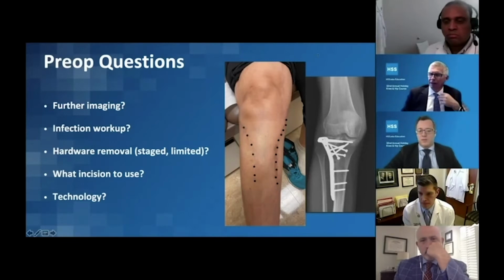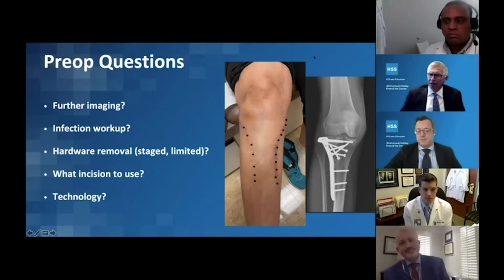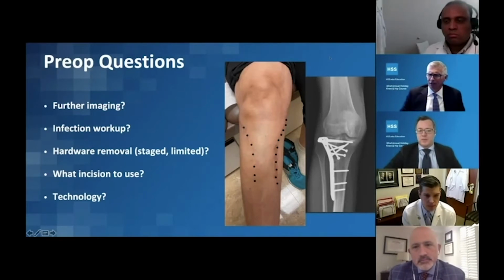I agree with that. That's certainly my overall approach. But suddenly with the 2 incisions and there's a lot of screws. It's not just a plate with some screws. All those screws coming from medial to lateral get me a little bit concerned. Yeah, same. What worried me here was just the sheer amount of screws in the metaphyseal area. Needed those removed. What incision are we going to use here, guys?